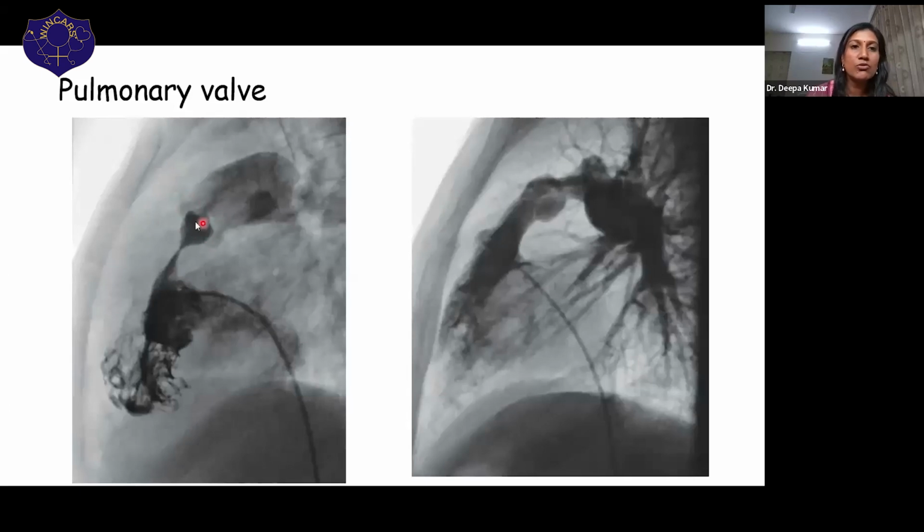You see that the pulmonary valve is not so doming as previously. So probably there is no valvar component to the pulmonary stenosis. There is only a severe infundibular stenosis. Here you see that there is no post-stenotic dilatation. That itself should give you an idea that it is probably a dysplastic pulmonary valve. You see the leaflet thickening is not very visible, but what is very apparent is the supravalvular tethering. You see that the valve is tethered on the superior aspect in the MPA. So you are unlikely to get a good result for both these cases.